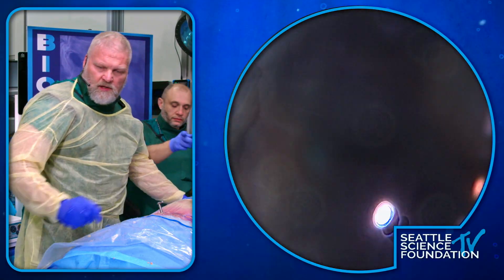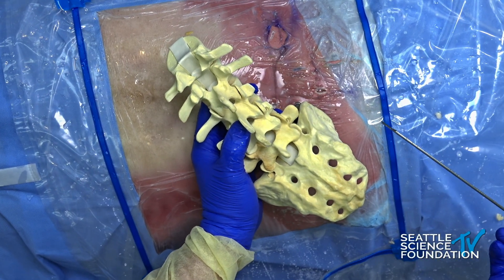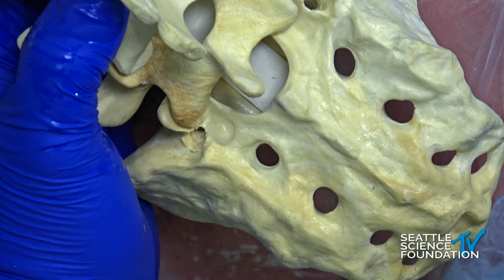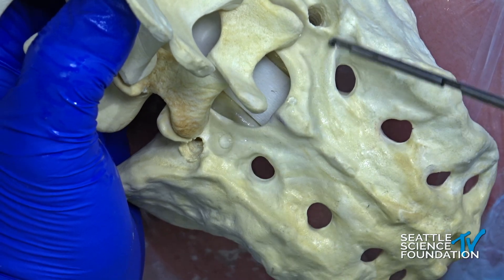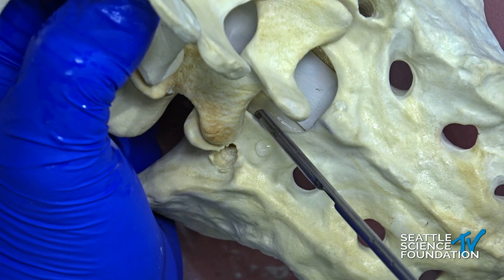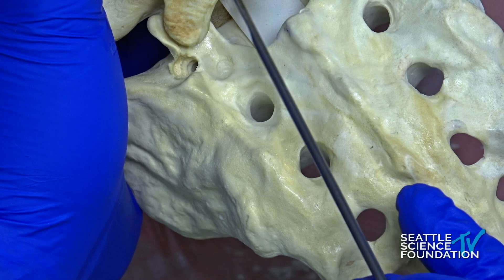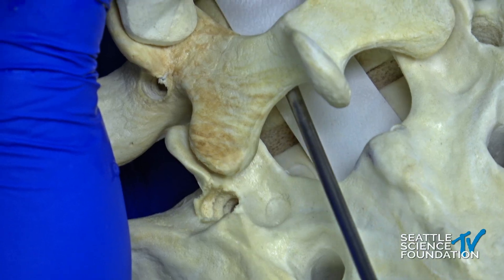On the bony model: for the lateral recess, use the straight osteotome to make little dotted lines that cut just through the bone along the lateral recess, then grab a Kerrison and come in to break that piece off. You end up grabbing the piece of bone with the ligament attached — you bite it, break it, and it becomes a handle for the ligamentum.